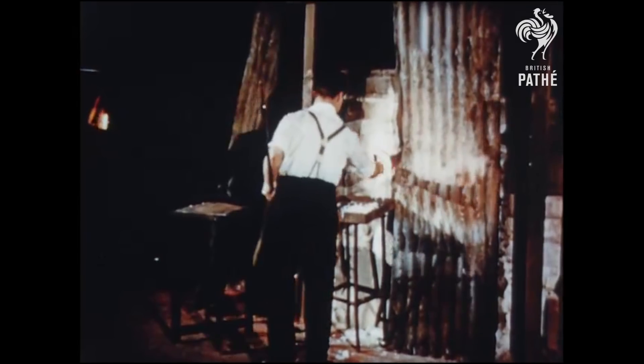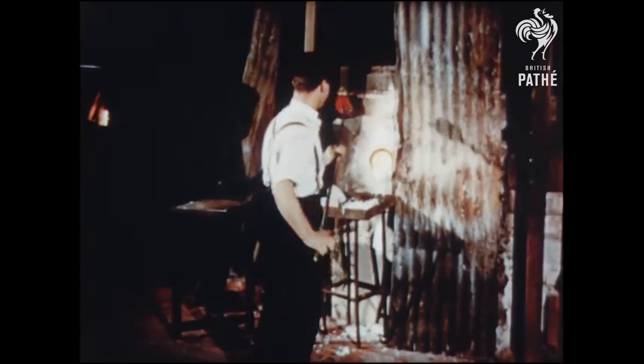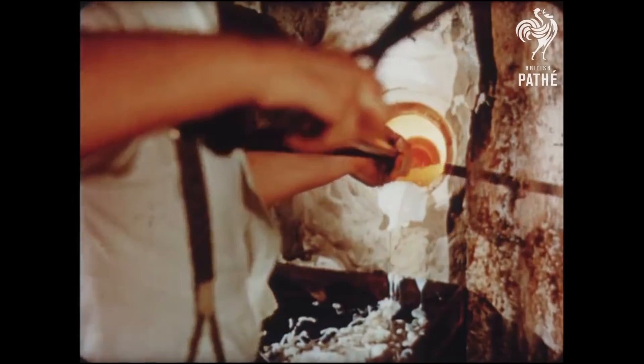Ever wondered how thermometers are made? In a foundry at Wealdstone, glass makers work skillfully to make one of their most delicate products: thermometer tubing.